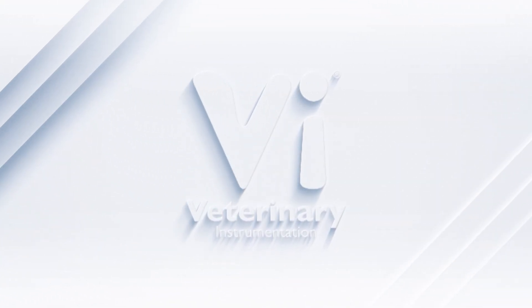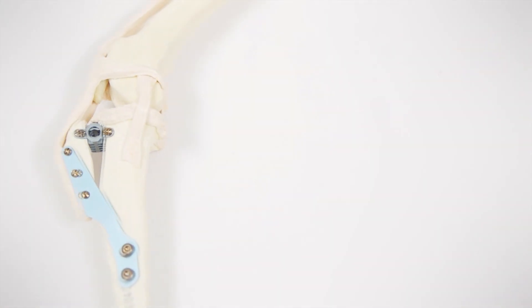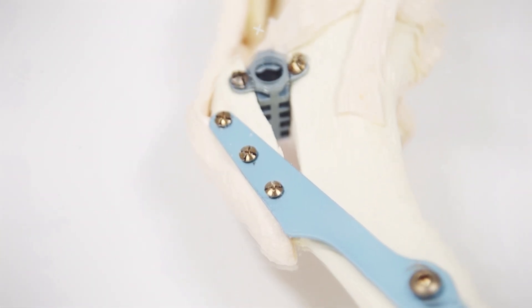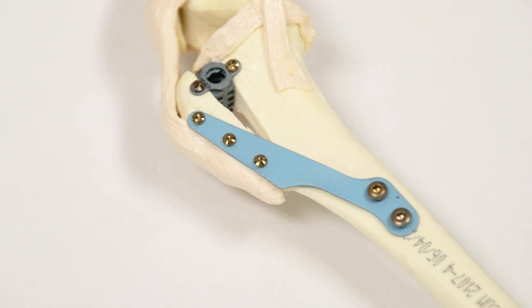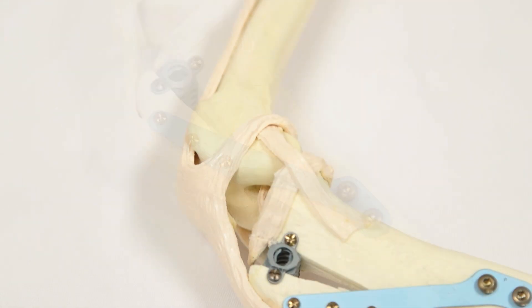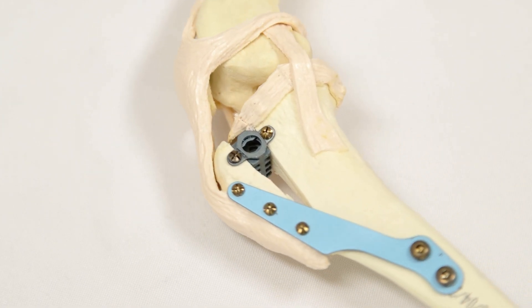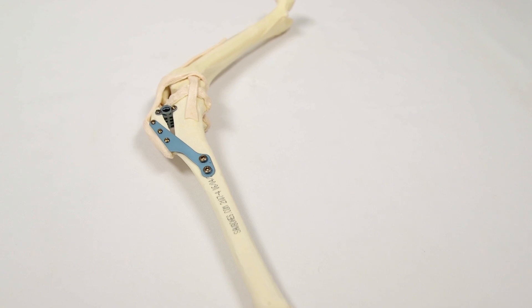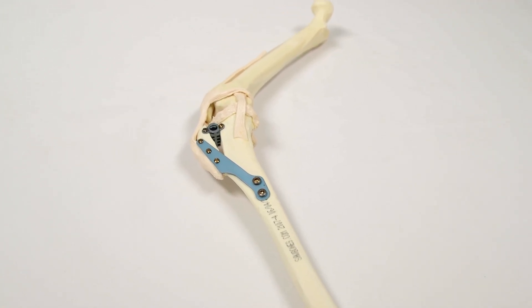Hello and welcome to Veterinary Instrumentation's latest episode of Under the Skin, a videography series introducing key devices and techniques used during orthopaedic surgery. In this episode, we are looking at the Tibial Tuberosity Advancement Procedure, or TTA, for stabilisation of the stifle following cranial cruciate ligament rupture. This episode explores the TTA procedure performed using a forkless plate.